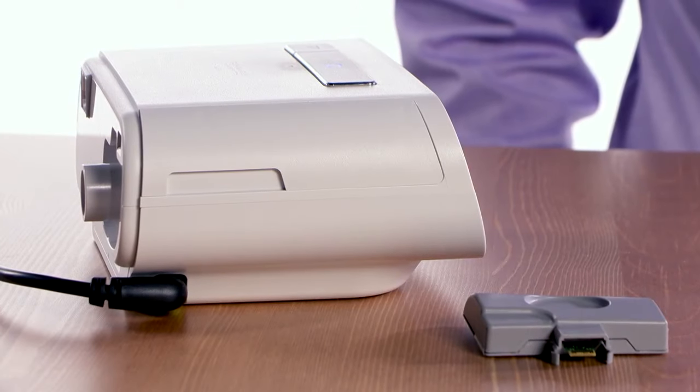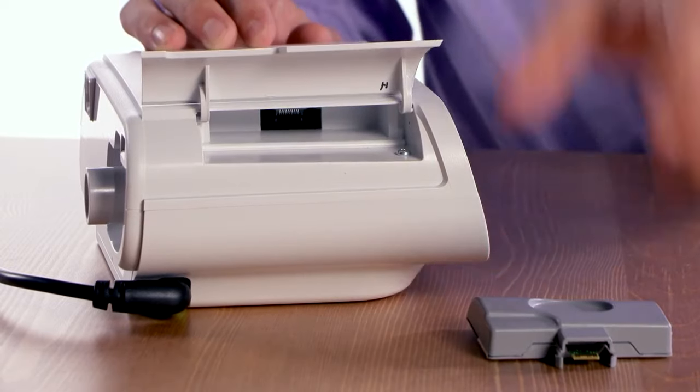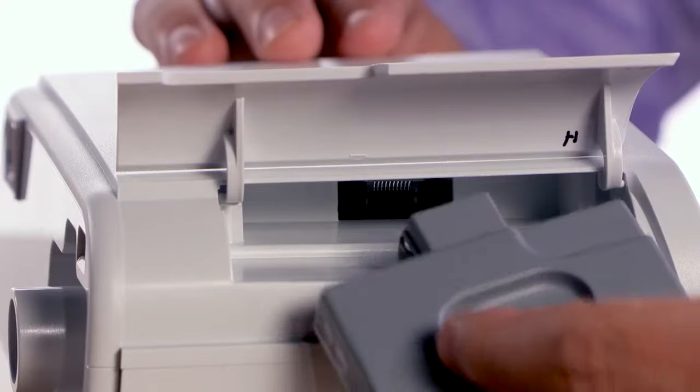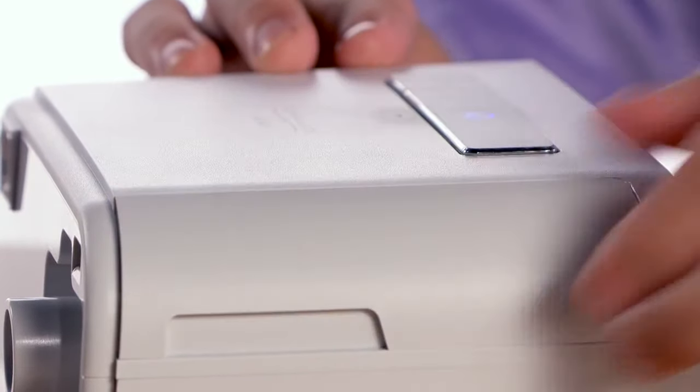To install a modem in your therapy device, open the accessory door. Insert the modem module into the accessory bay connector end first. Gently press the modem until it clicks into place. Now close the accessory door.